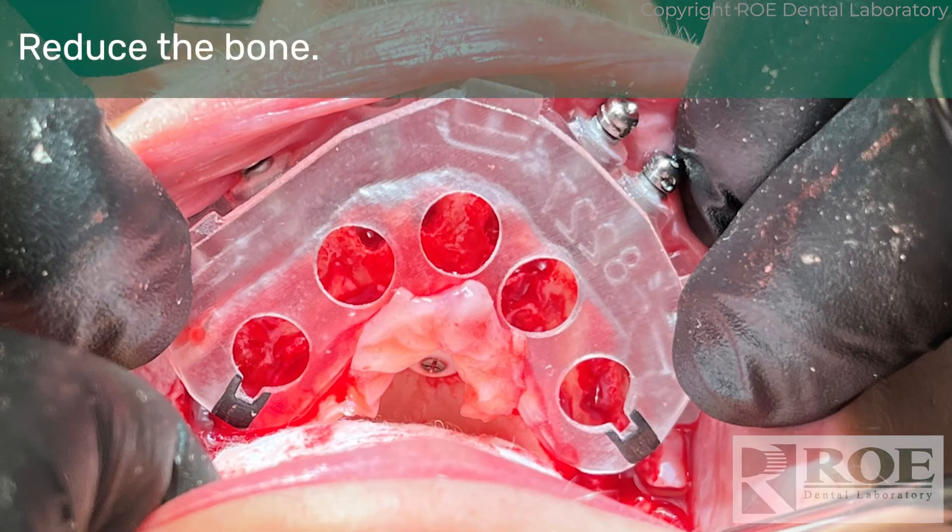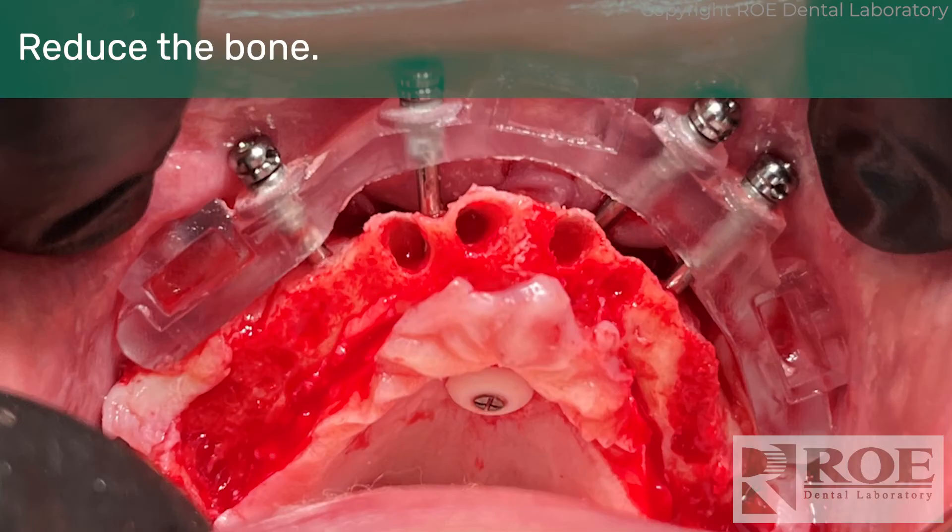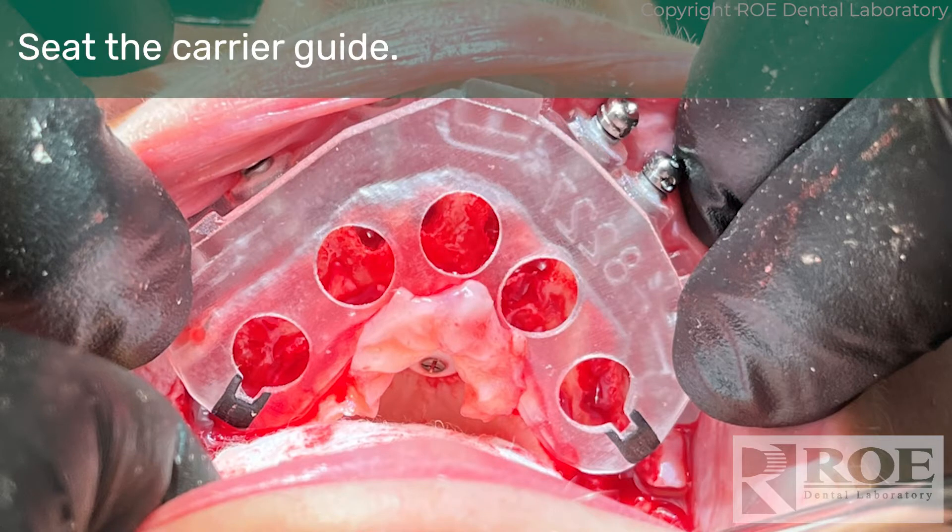The doctor will reduce the bone down to the level of the fixation base — this is the guide for reducing. Once you think you've reduced enough, you try on the carrier guide. If it seats passively, you know you've reduced the bone enough underneath it. If not, go back and reduce more, then come back and try again. Once it's passive, you know the bone is reduced. It's a feel-and-visual process to make sure there's an adequate bone reduction.